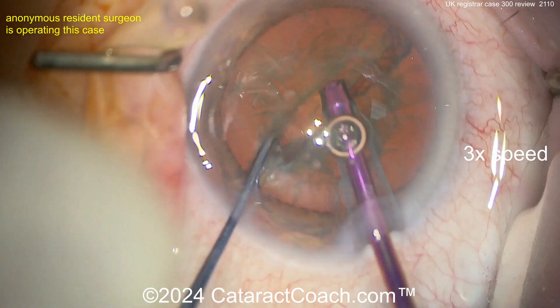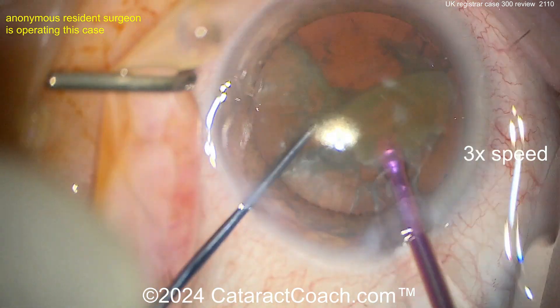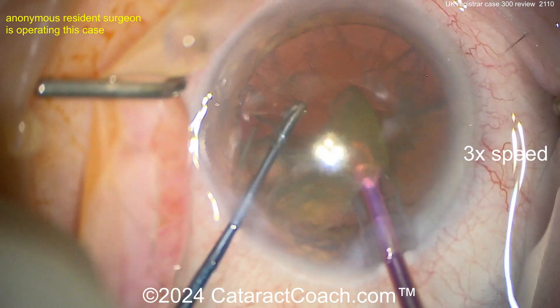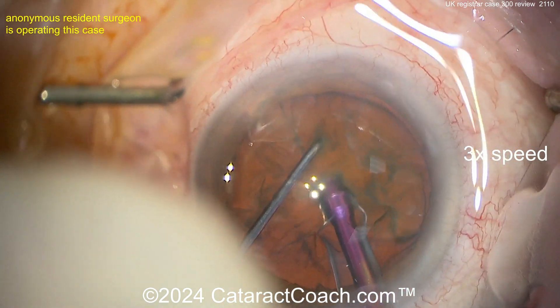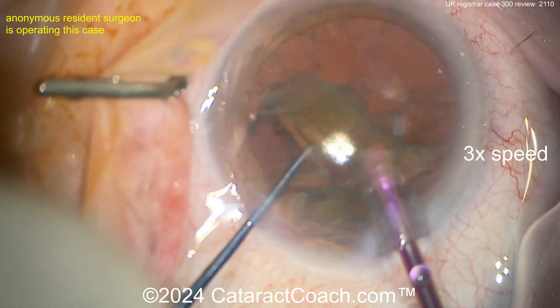Now another chop — beautiful, a little bit of combo chop there. Nicely chopping that one hemi-nucleus into two quadrants, very efficient. Rotating it again and then buzzing in and chopping it again — beautifully done. Very nice stop-and-chop technique.